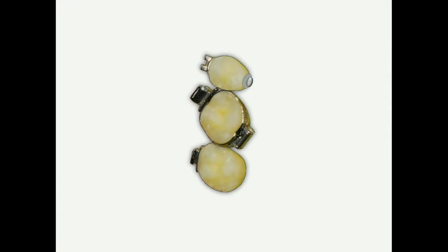Here we have a badly rotated molar. The simplest method would be applying equal and opposite force by two elastics. The molar would rotate in correct direction by couple, and this movement is what we want. However, not only molar rotates, but adjacent premolar and second molar will rotate at the same time, which might be undesirable. Therefore, applying couple using two elastics are not indicated in this case.